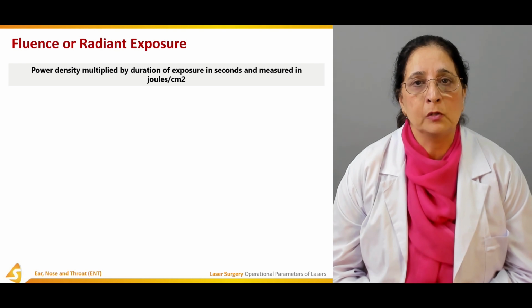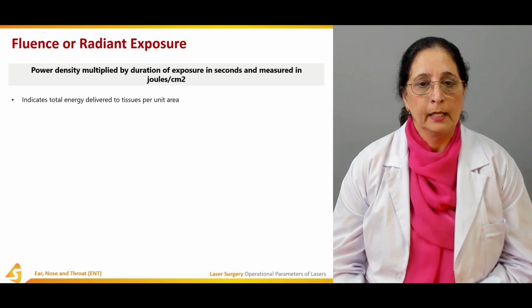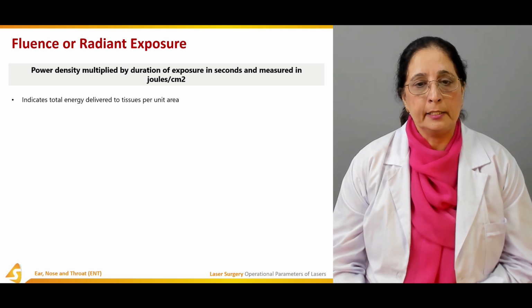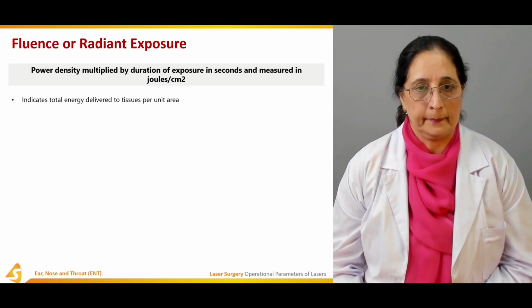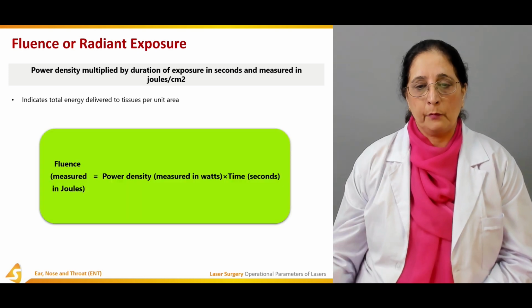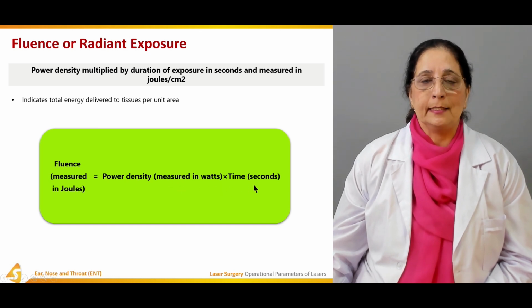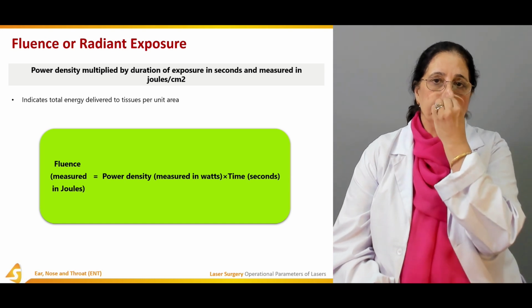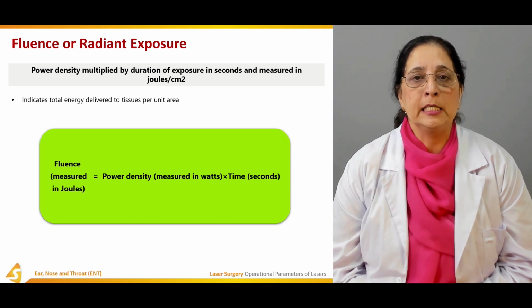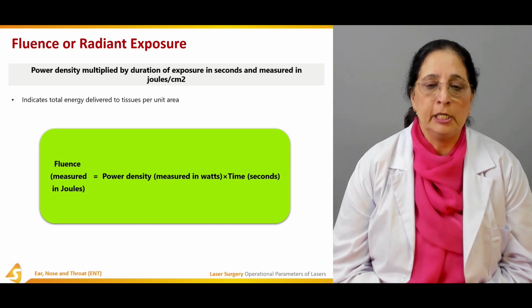It indicates the total energy delivered to the tissue per unit area, power density times the seconds of exposure, and it's measured in joules.